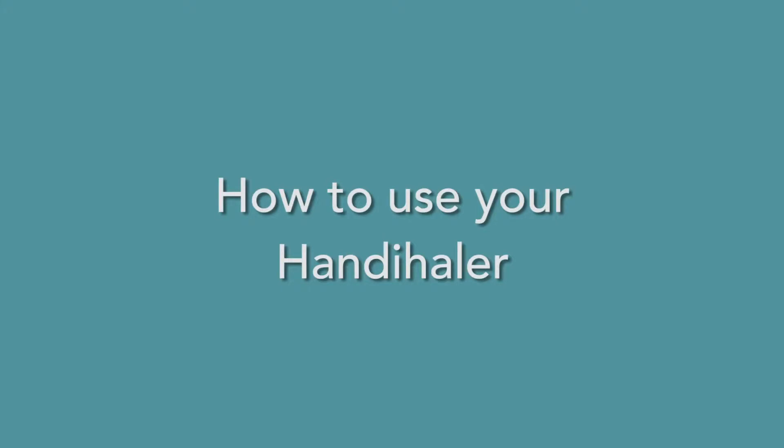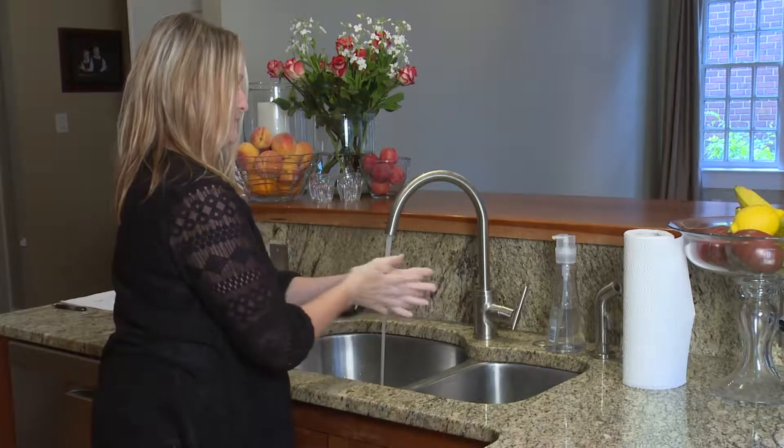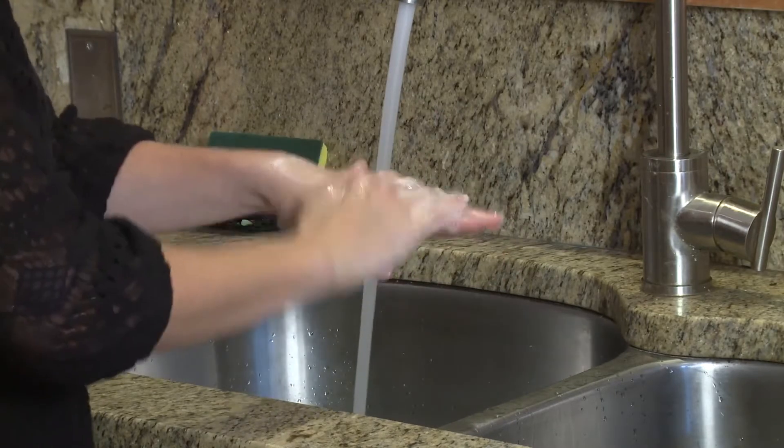How to use your Handihaler. It is important to wash your hands with warm soapy water and then dry them completely before using your Handihaler.